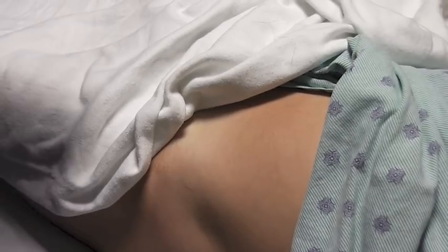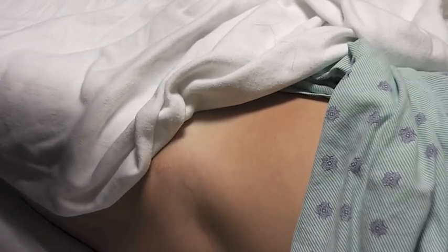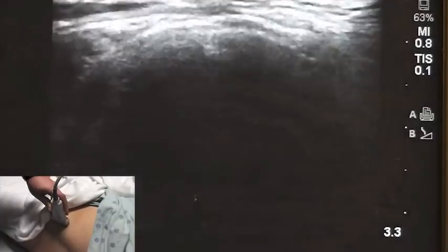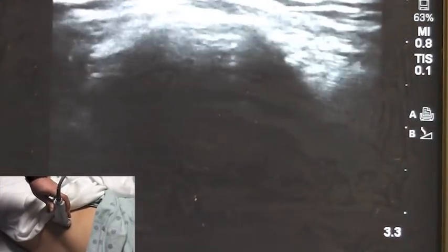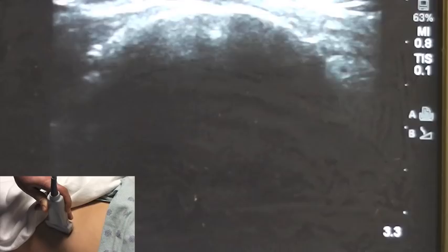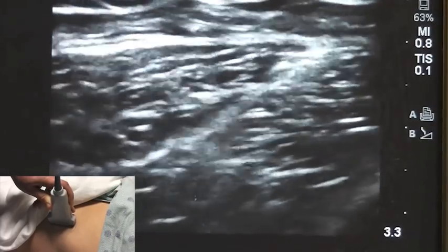In order to perform this block, I usually stand on the side of the patient where the block is being performed. I position the probe in the cephalad to caudad position on the anterior superior iliac spine, which you can feel in pretty much every patient. If you look at the ultrasound screen, the ASIS is right here. After that, I move my probe slightly caudad and turn it facing the patient's belly button.